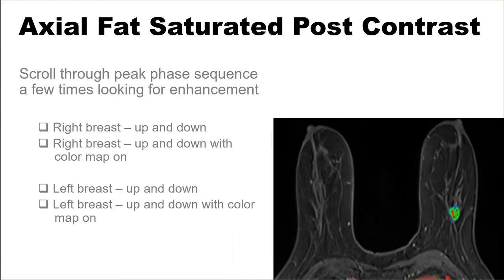Scroll through the peak phase sequence — usually phase 2 or the second sequence. Scroll back and forth up and down throughout the right breast, and then the left breast, with the color map on. This will ensure that you don't miss any subtle enhancing lesions.